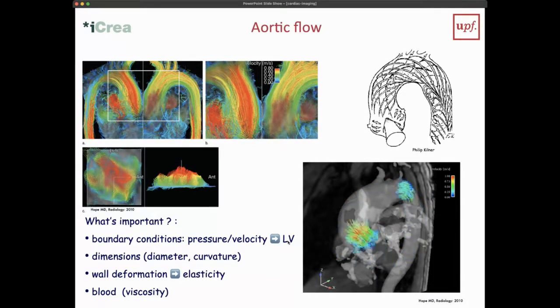Here is an example, measured with MRI, of the flow within the aorta, and you can nicely see here how it spirals. So this is actually a kind of exaggerated spiraling in an aorta which is dilated. This is actually a patient with an abnormal aortic valve, but even in a normal aorta, you have spiral flow. And this is again an example, which is to me a typical example of how nature evolves always towards trying to preserve energy.